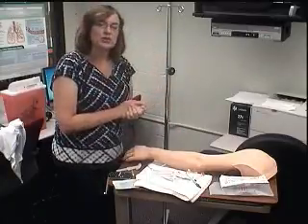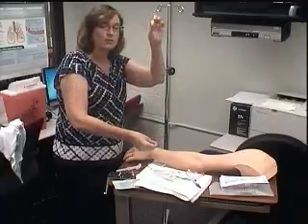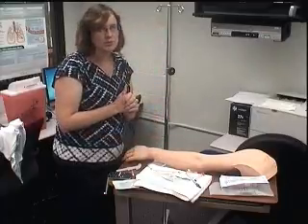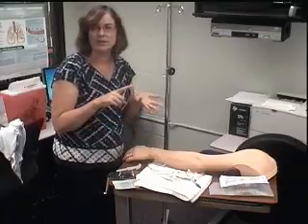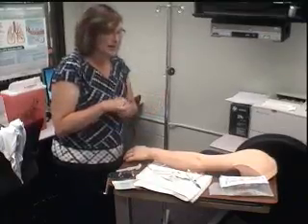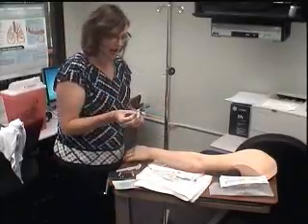Instead of hanging it directly, you can hang directly from the IV tubing and hang it directly into the line, which sometimes happens in the ER, or sometimes happens in the ambulance, or sometimes happens in the OR. But since I'm up on the floor, I'm probably going to go ahead and take the extra time to put in a saline lock first.